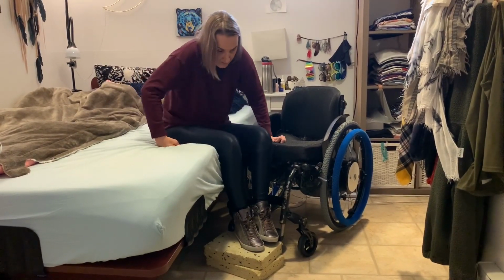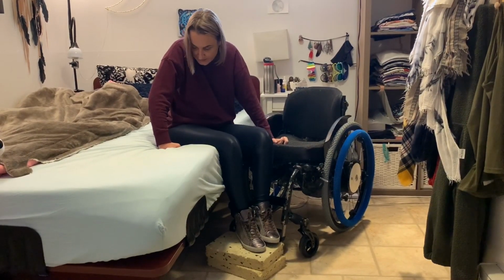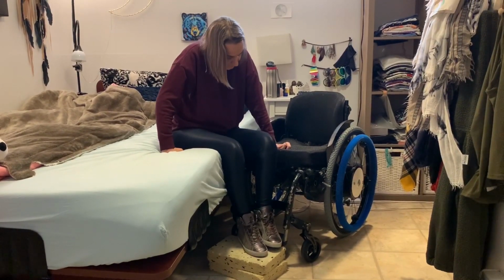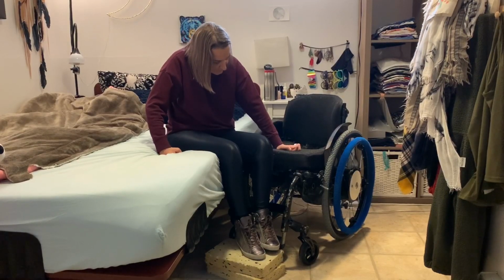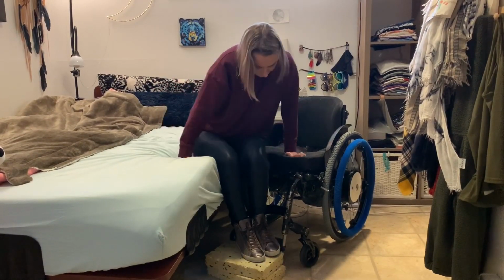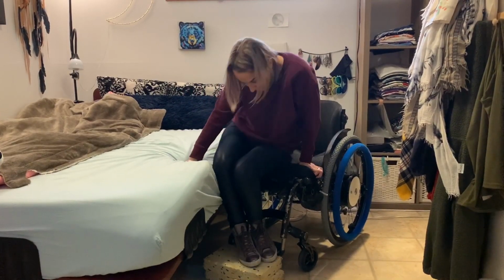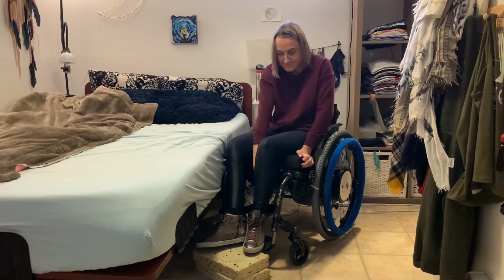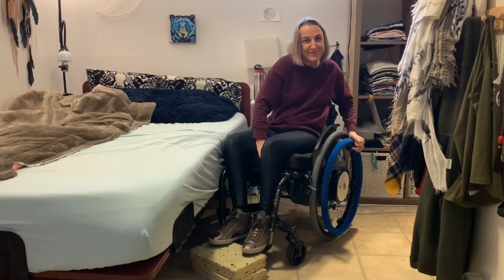And again, moving your weight forward, pushing up a little bit with your right hand while you're pushing towards the chair, and with your left hand pulling to go towards there, and then just use the momentum to transfer over. There you go, that's how you do a transfer.